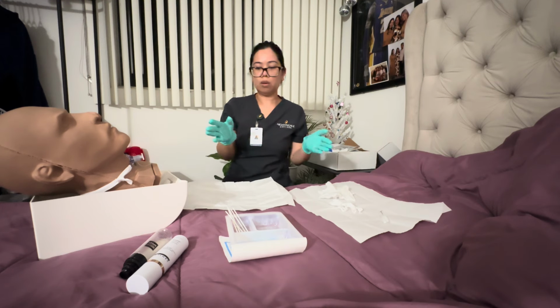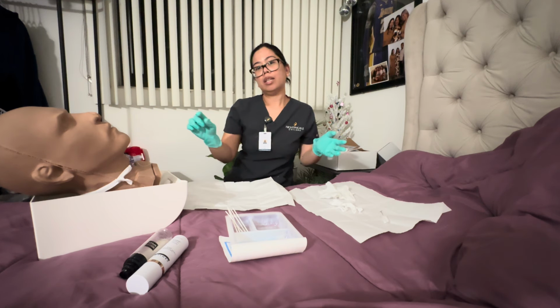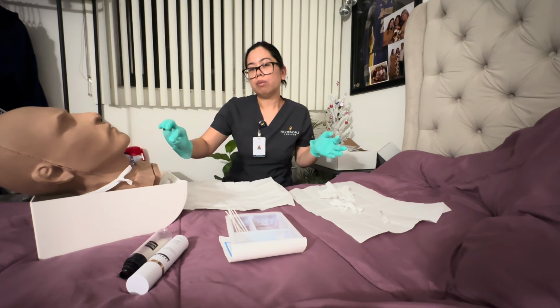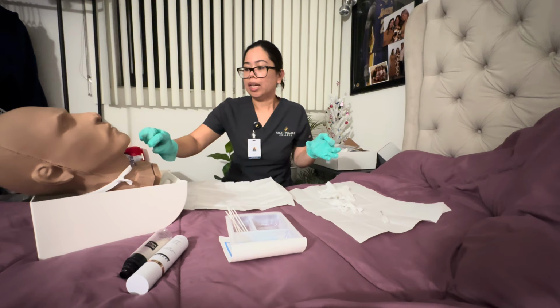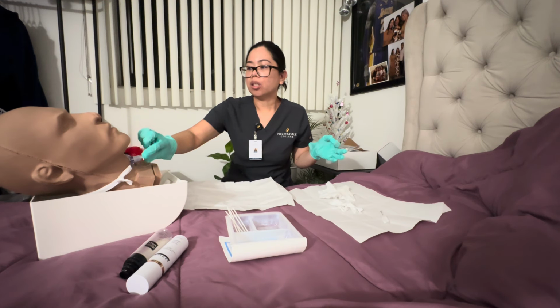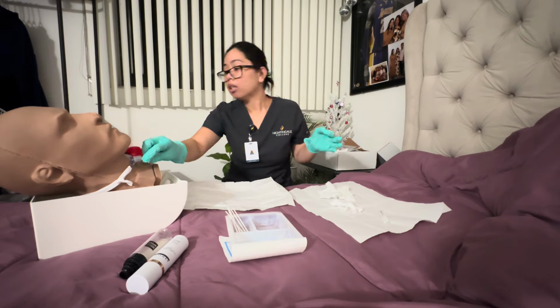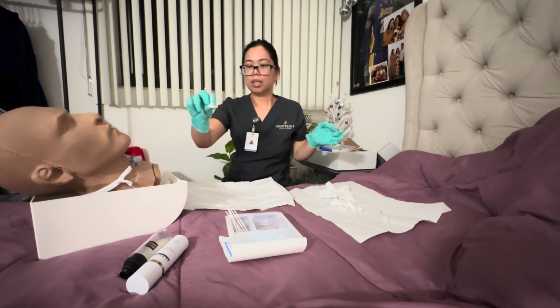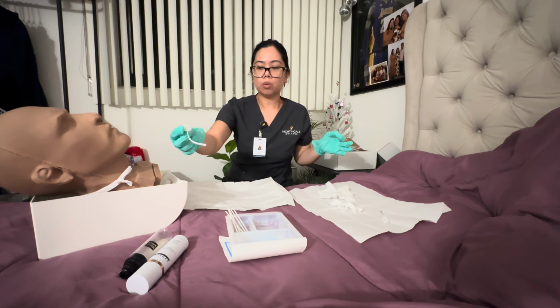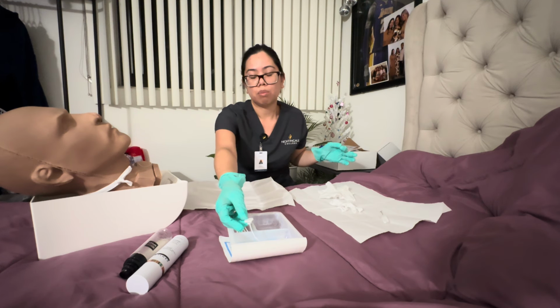Okay, now that we all have that set up, what we want to do is I'm going to unlock and remove the inner cannula, and I'm gonna take it out along the curve, along its natural curve. So you unlock, and then you're gonna remove along the natural curve.